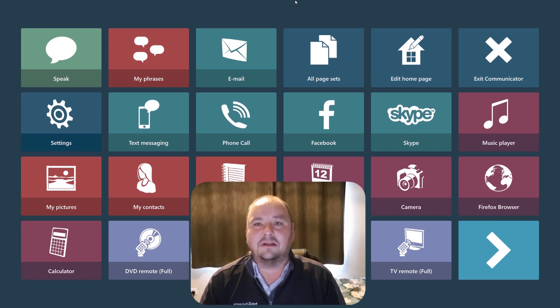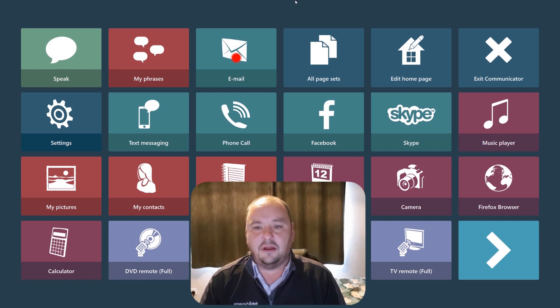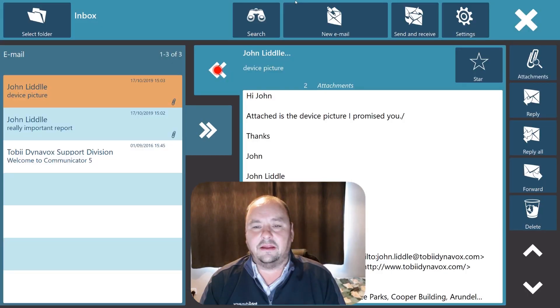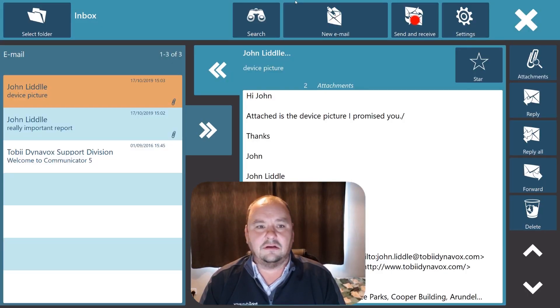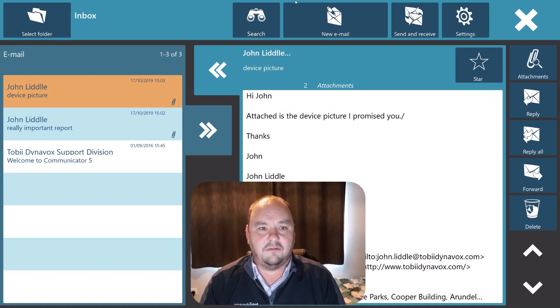So let's have a look at how the emails work. I'm going to from my home page look at the email icon because I'm using eye gaze at the moment. I can look at send and receive to see if I have any new emails.